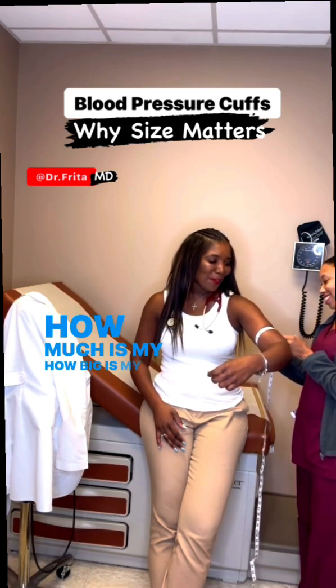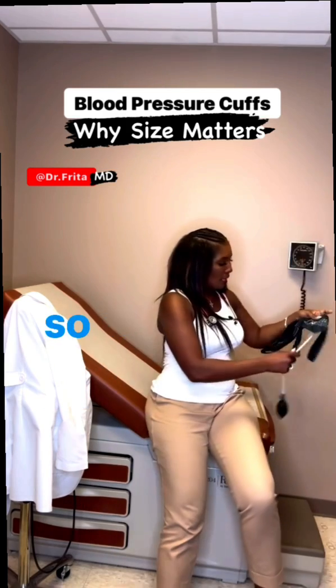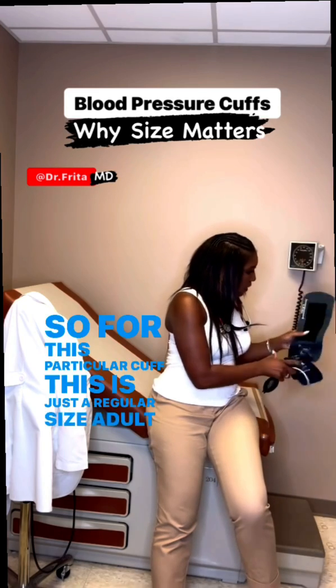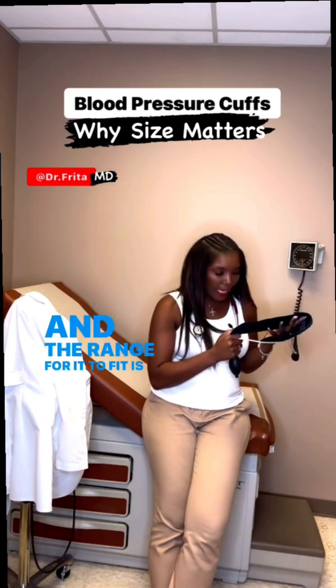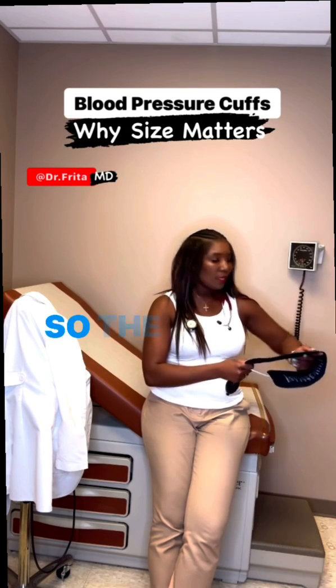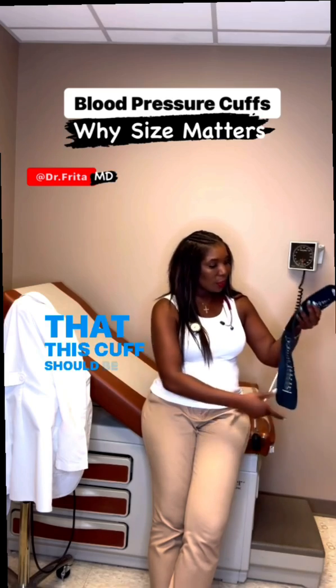How big is my arm? You are approximately 12 and a half inches. So for this particular cuff — this is just a regular size adult cuff — the range for it to fit is 9.8 to 13 and a half inches. So the circumference of my arm is 12 and a half inches, so this cuff should be right for me and will give me an accurate measurement.